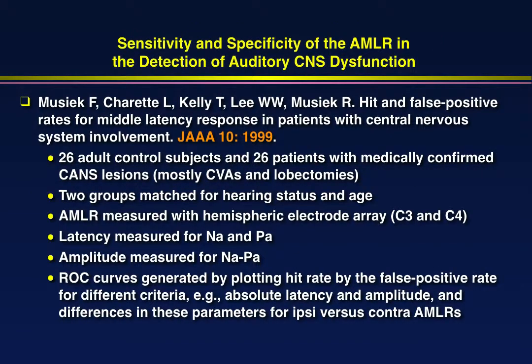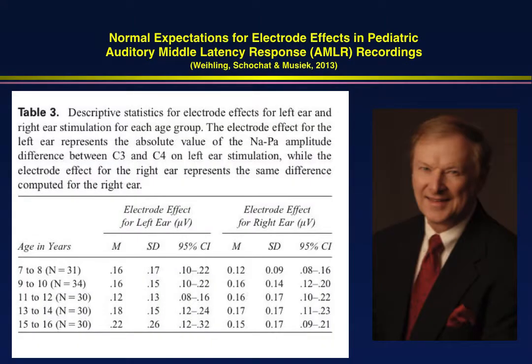Frank Musiek, as I've mentioned, has done a tremendous amount of work on this. He's published many papers. This is just one of many. I encourage you to read his work, talk to him, read his books. He's actually got normative data, he and his colleagues, many of whom are former students or fellows that have worked with him, normative data that you can use, and you can follow his protocol to record a middle latency and use his normative data to analyze it.